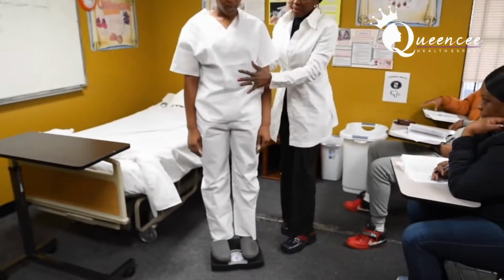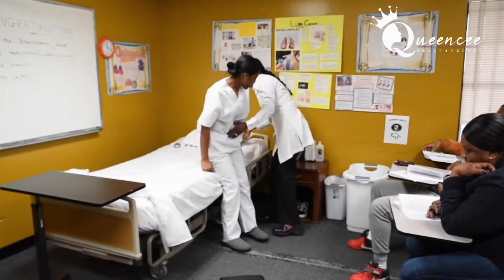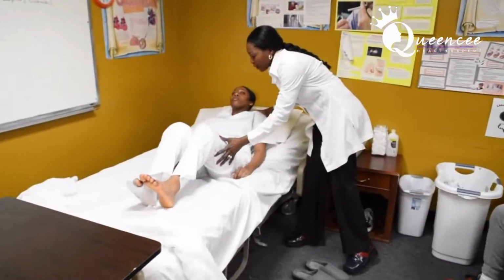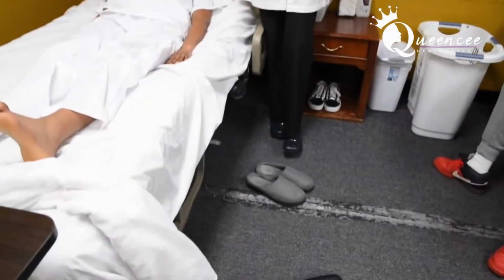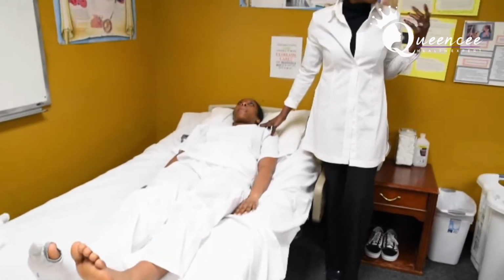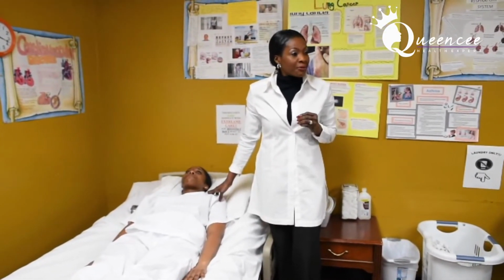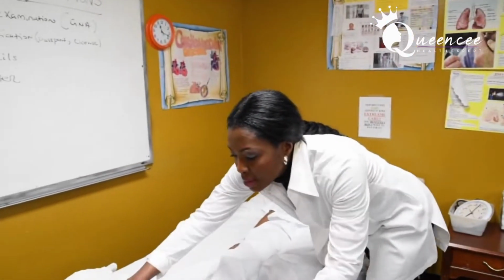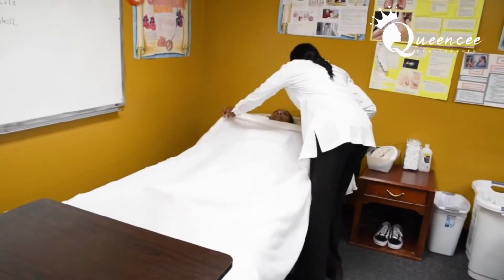Okay, help my patient off the scale. We're gonna walk back to the bed. She took the shoes off for me. And as you are doing the exam with your classmates, because they know the skill, they may take their shoes off for you like she just did. But if they do, they have to make sure that their feet does not what? Touch the ground. All right. So if you do that, please make sure your feet doesn't touch the ground, or else the CNA will be penalized.